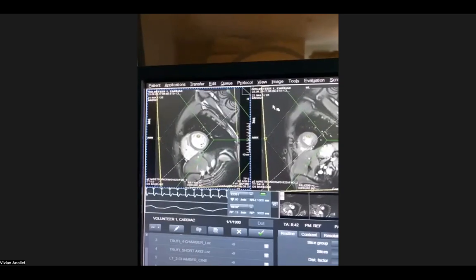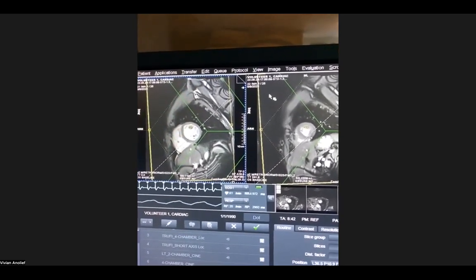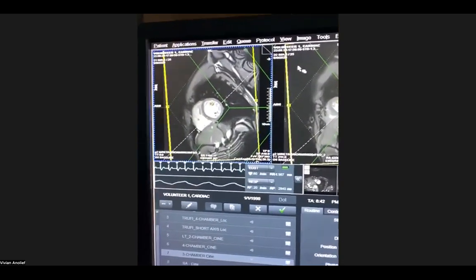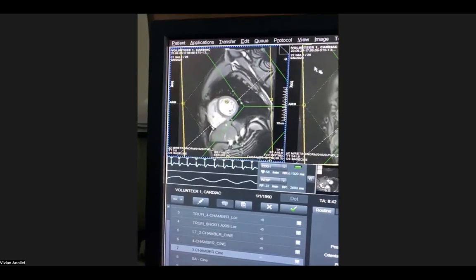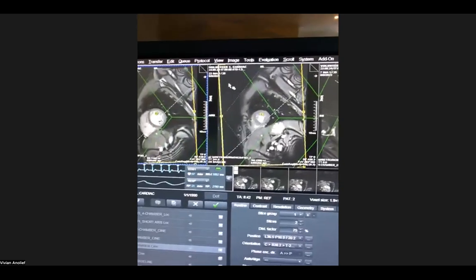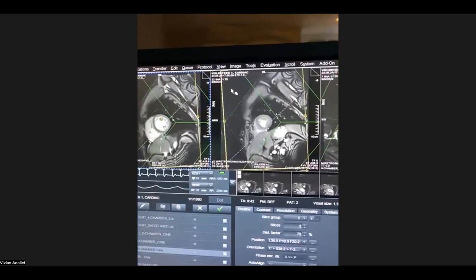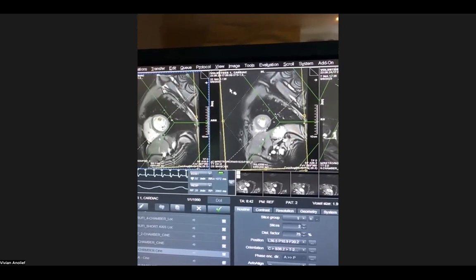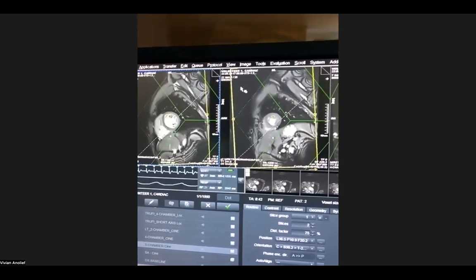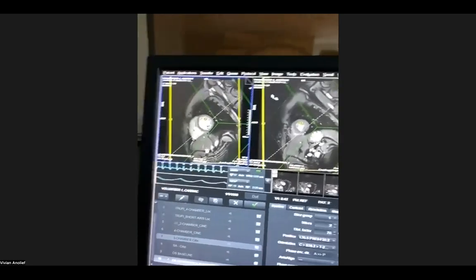So I'm going to stop sharing my screen. If Vivian's thing got unpinned, just pin her video again so you can follow along. Before we run this acquisition, we usually talk to the subject or the patient to make sure that he remembers what he has to do. So Wally's just going to talk to him and say exactly what's coming. We have 1 minute of free breathing, followed by 1 minute of breathing with the metronome called hyperventilation, and then breath hold for as long as he can, ideally for a minute. Okay, go ahead, Wally.